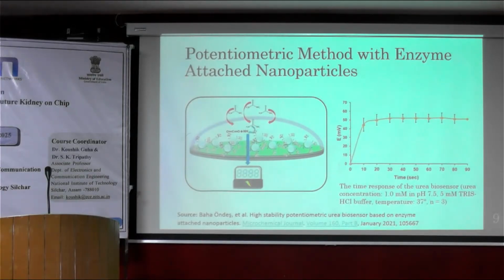Nevertheless, we are usually talking about a biotechnical system where we have to monitor urea for more than 5 years, because we expect the implantable artificial kidney to work within the human organism. We at least have to adapt this system so it will work continuously for at least a few years, 1 to 5 years at the very least.